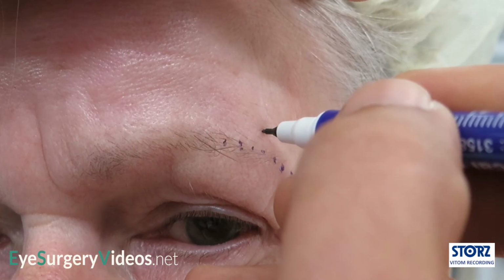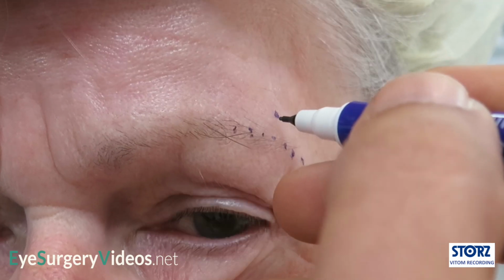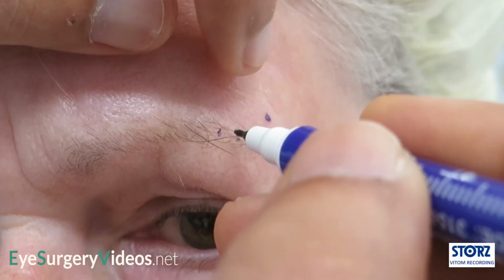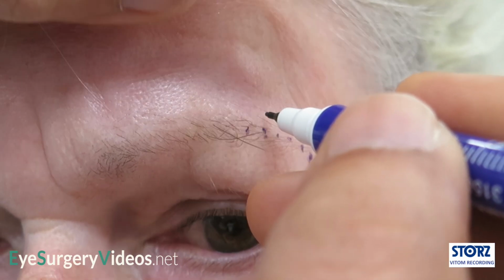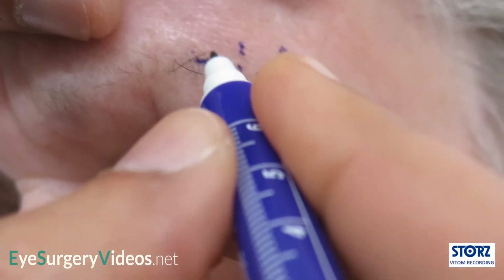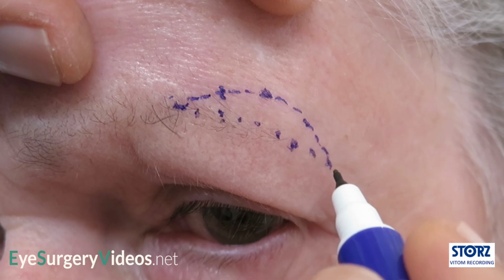The brow is now lifted to the desired position. The marker pen is suspended in line with the lower incision, and the brow allowed to drop. The marker pen is now sitting at the desired superior edge, and the mark is made. The same technique is used to make several more upper incision skin marks. The line can then be completed.